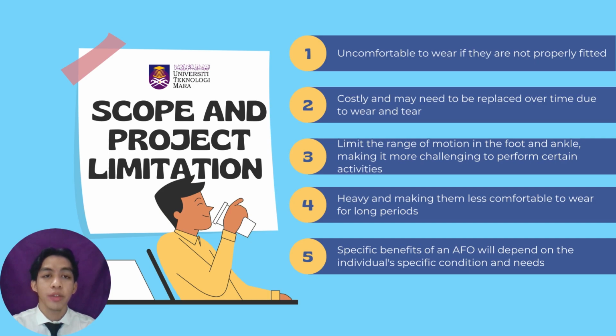There are several limitations to consider in designing an AFO. These include comfort, durability, range of motion, weight, and effectiveness. Some users may find that AFO are uncomfortable to wear, especially if they are not properly fitted. These devices can be expensive and may need to be replaced over time due to wear and tear.